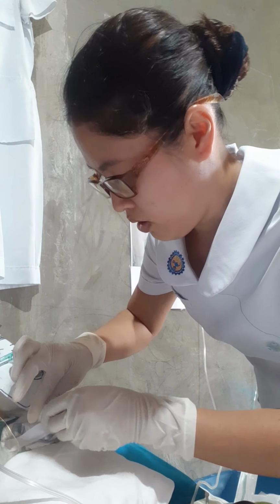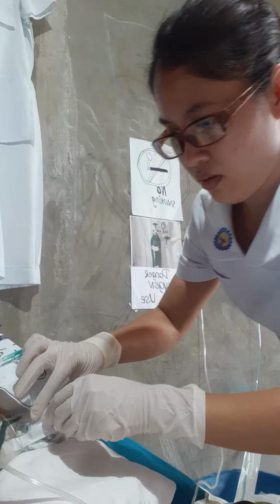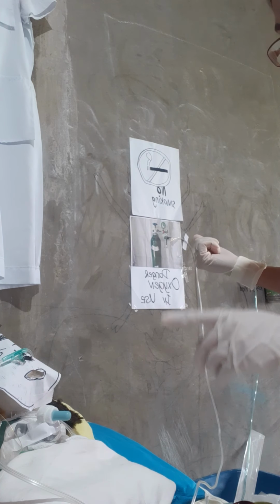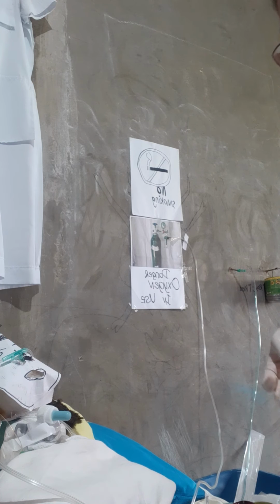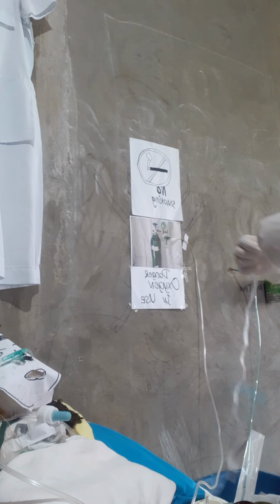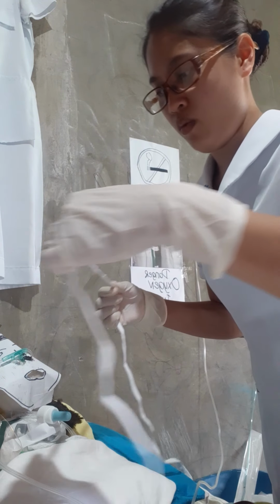Oh my gosh, why are you going out? And next, after we put that, we need to change the tape. But before changing it, we need to place a new one.